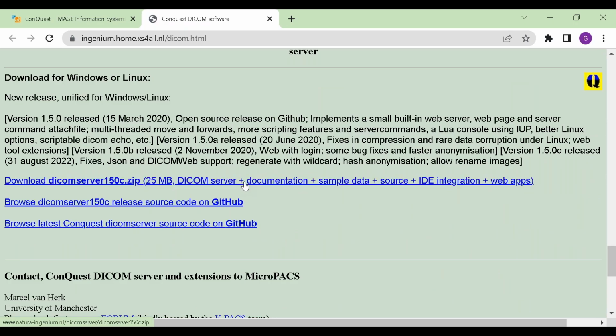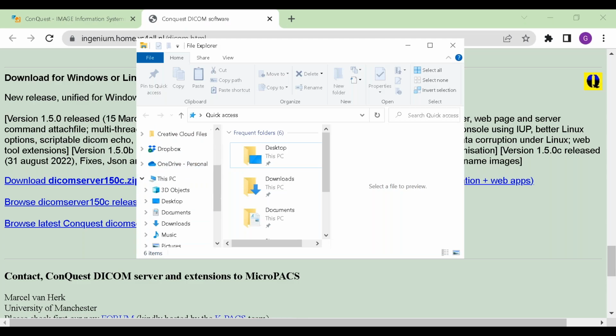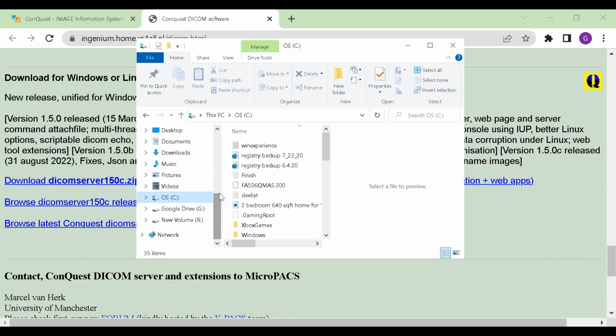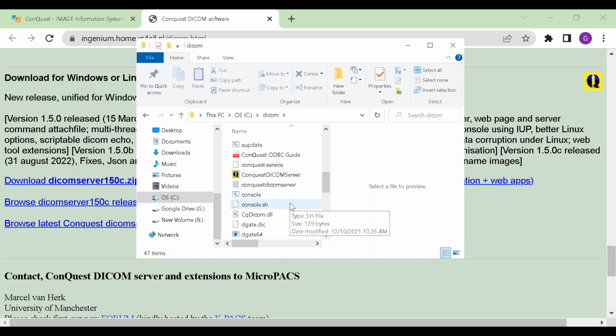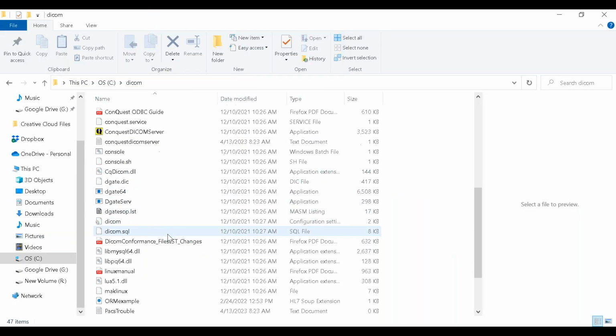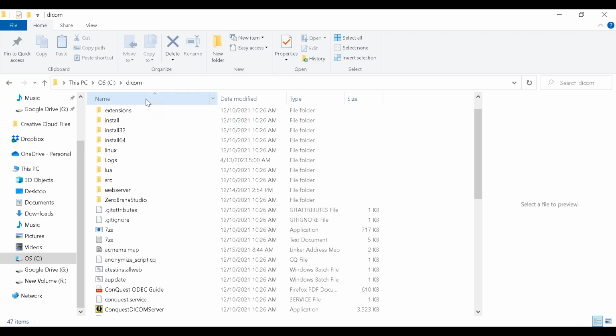You go ahead and you click on that, and it should download that file, and I don't know if it's downloading that file right now or not. Whether it does or does not is immaterial to me, because I've already gone ahead and accessed that file. Now I'm going to tell you where I put it. At risk of showing you everything on my computer hard drive here, I'm going to recommend that you take this file and drag it into a folder marked DICOM on your root C drive. Create a folder called DICOM.